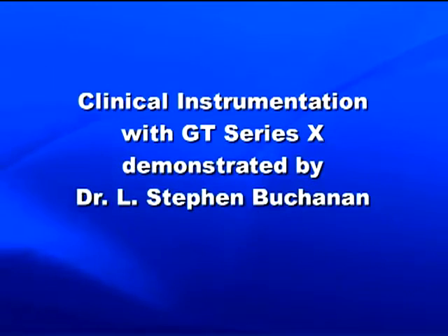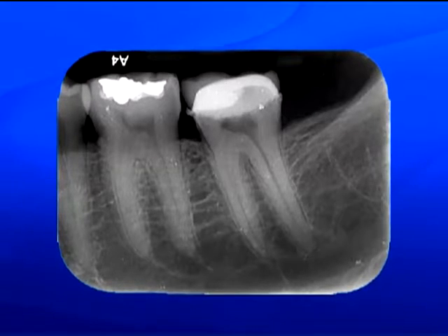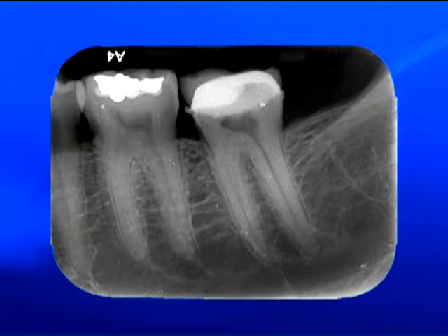Dr. Steve Buchanan, the developer of the GT Series X instruments, demonstrates their use in this clinical case. This is an X-ray of the tooth that I will use to demonstrate the GT Series X files. The root structure can be challenging because of its length and relatively narrow roots.